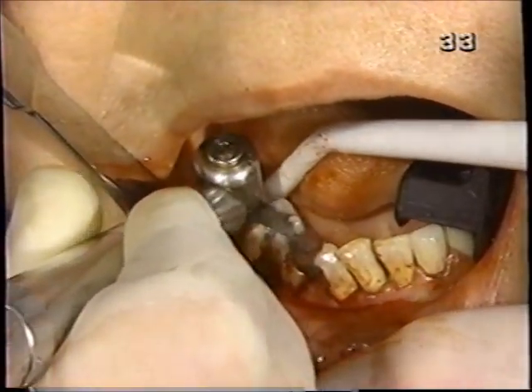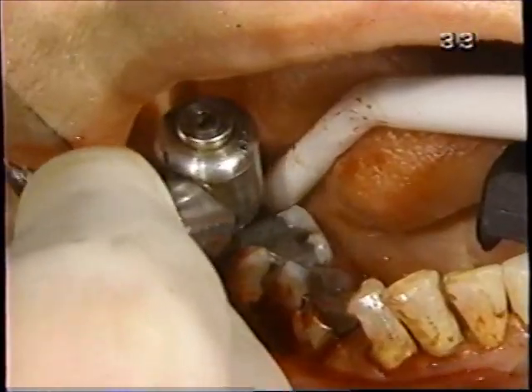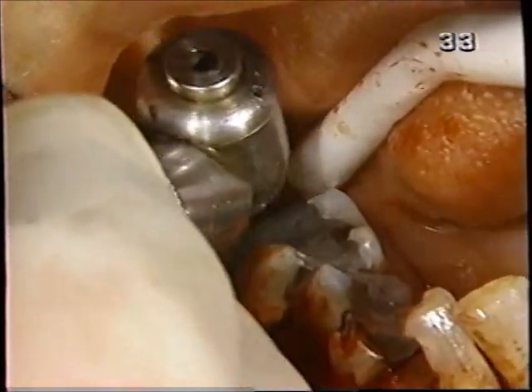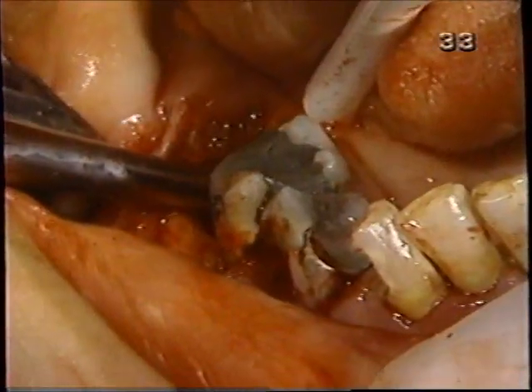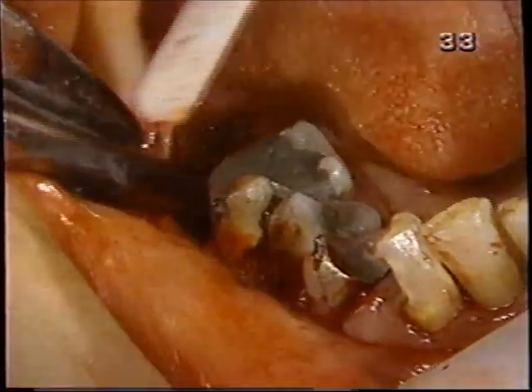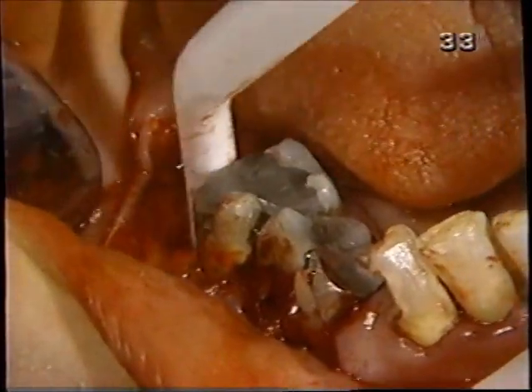Now by removing inter-radicular bone, we're not increasing the wound size at all, but yet we're removing some of the body's hold on that particular root. There it is.